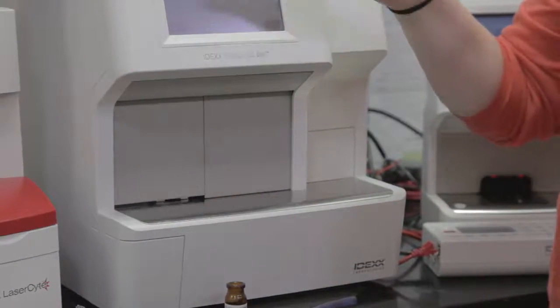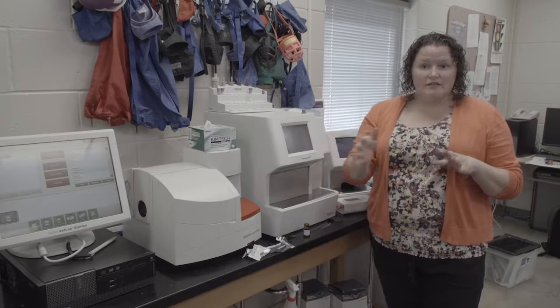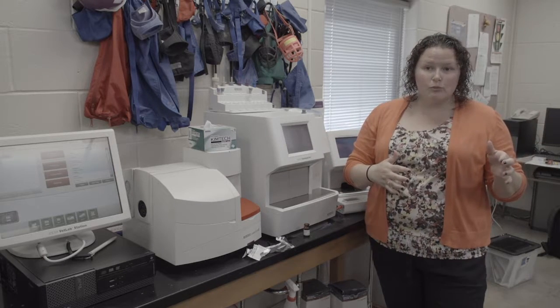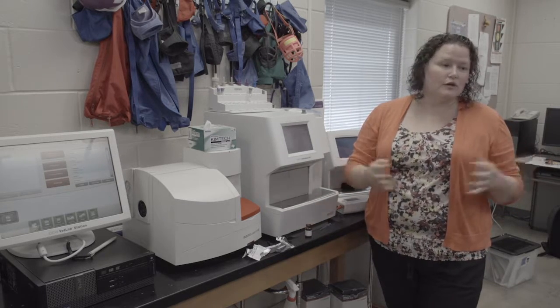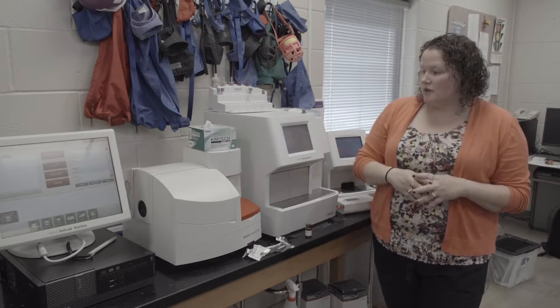So that's going to run. When it's done, it won't print the results. It will send the results back to the vet lab station, and so long as everything is in the normal range, we're good. If anything would be high or low, you're going to want to contact customer support, and they'll talk you through some troubleshooting. Mainly, was this mixed appropriately? Did you clean it? What values are out of range? And so forth. Okay? All right. So now we wait.